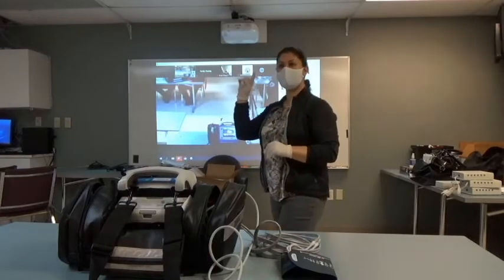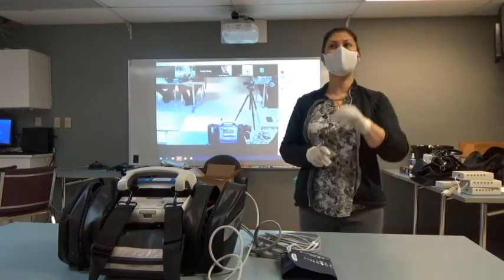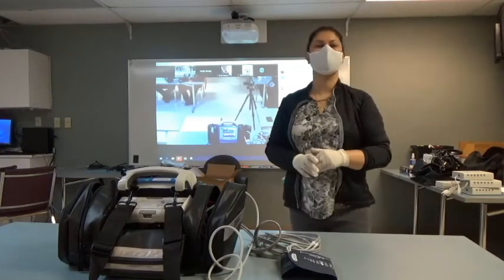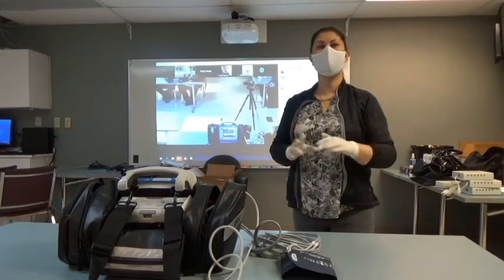Does somebody have a yellow light flashing on the top of their device right now? We do, yeah. Okay. What does the yellow message say? Does it say printer door open? Yes. Okay. So how do we make that quiet?